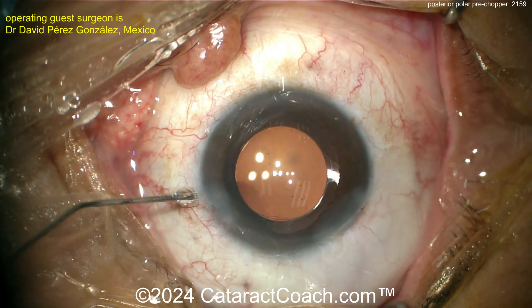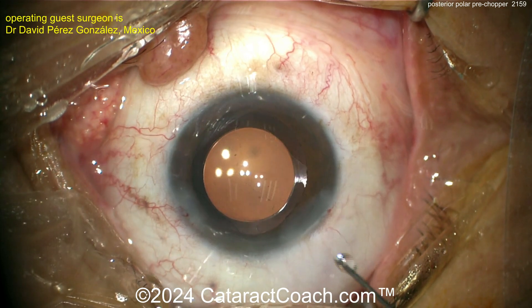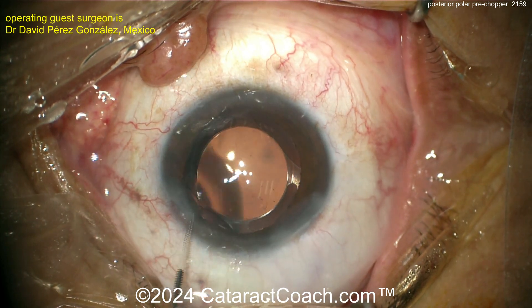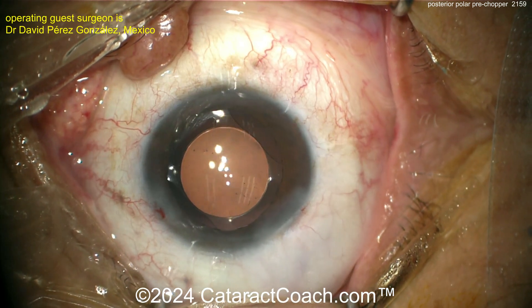That small Descemet's attachment at the main incision is really of no consequence. What ends up happening is it'll go back into position and the endothelial pump function will hold it back in place — shouldn't be an issue. Just make sure the incision is nicely sealed. That's a beautiful case. Thank you for sharing — I think you learned a lot, and so did I.